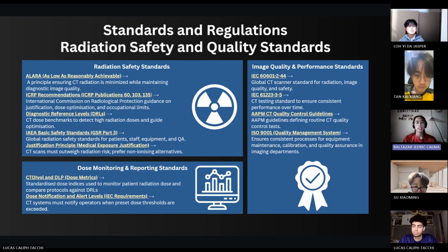Standards like IEC 60601-2-44, IEC 61223-3-5, and AAPM guidelines ensure CT scanners maintain safe operation and consistent image quality. Indicators such as CTDIvol and DLP are used to measure patient exposure.